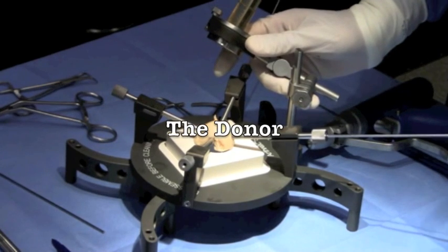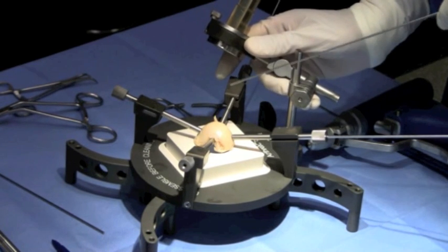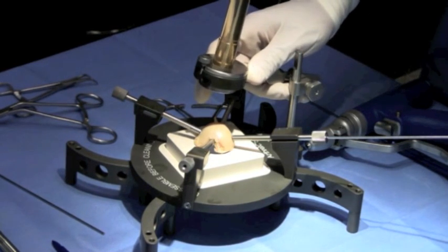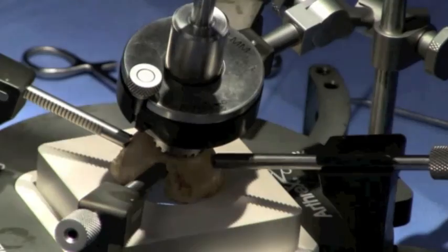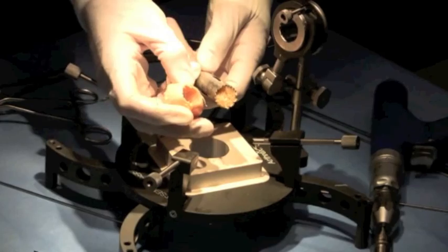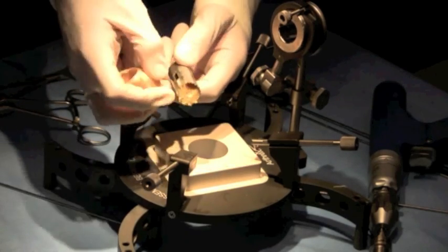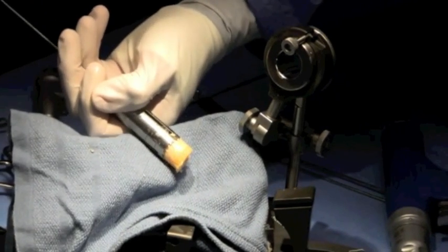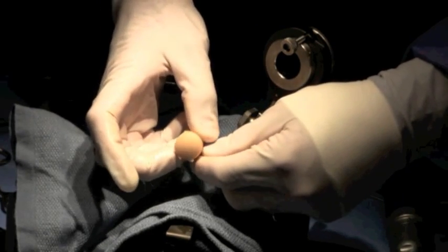This is a fancy, extremely sophisticated device that's meant to hold our donor perfectly in place, so that we can come down right on top of it and take out just the perfect specimen that will fit the defect that we're trying to fit. So now we've put the 20 millimeter reamer right on there. We can go ahead and take our donor. So you can see we've taken this core right out of the donor spot here, and we're about to prepare this so that it fits our recipient. We'll just tap this plug right out of here that we just harvested, and we'll fashion it to fit the defect that we have.